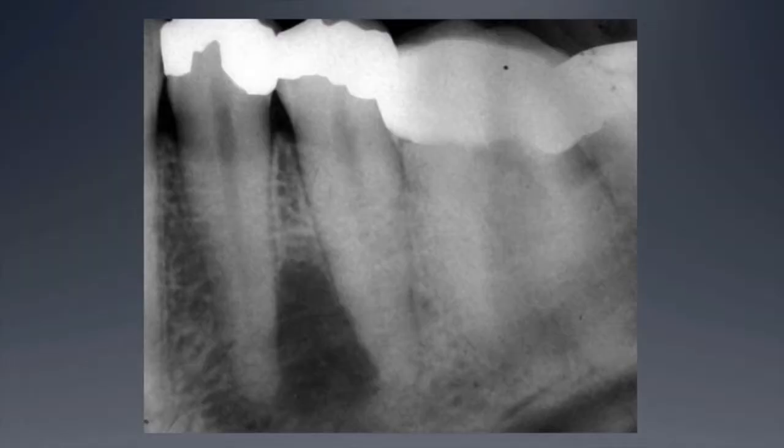Usually it's larger. Usually it's in the corner of the jaw, but that's not to say that it can't go in the apical area. And you can see that there's a little bit of resorption of the adjacent root as well. Yeah, good point. You don't normally see that kind of lateral resorption with periapical lesions that are granulomas. Sometimes you can, of course, and I guess that's really a key thing, that there are exceptions to every rule, right?